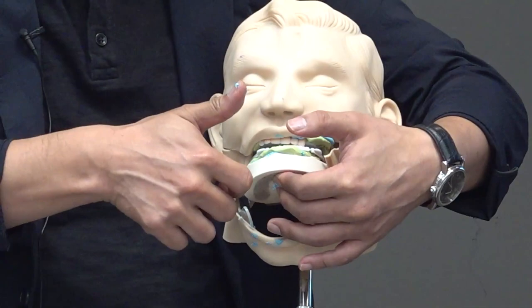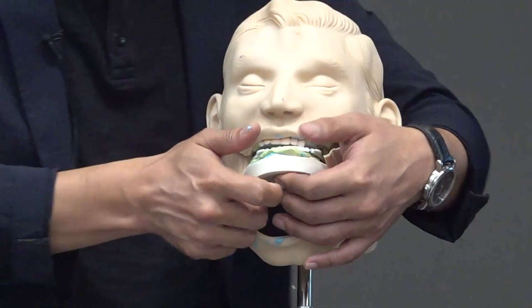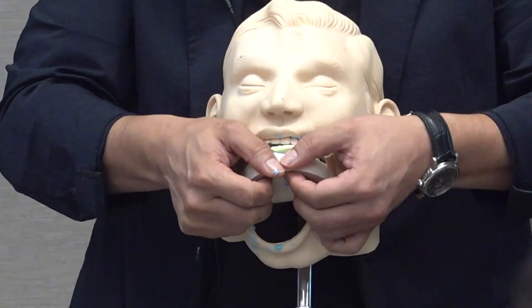Generally, many patients don't draw the Gothic arch tracing. So at that time, you have to use the bimanual manipulation method by Dawson. And then, the bite, please.